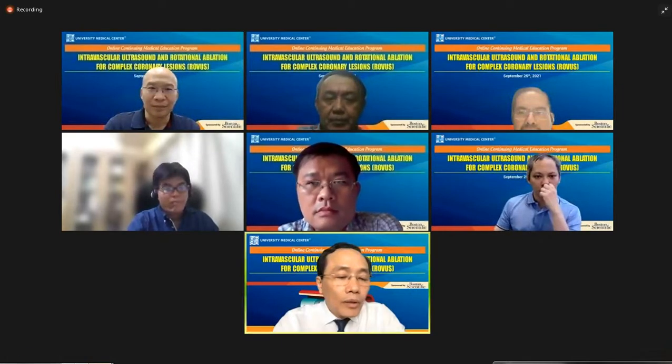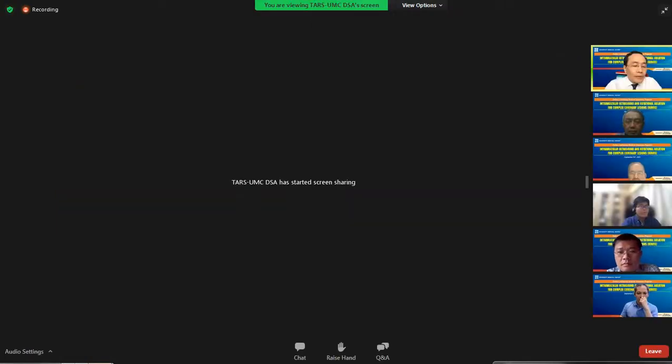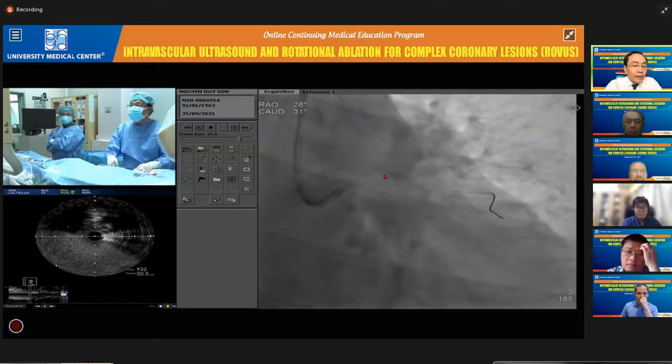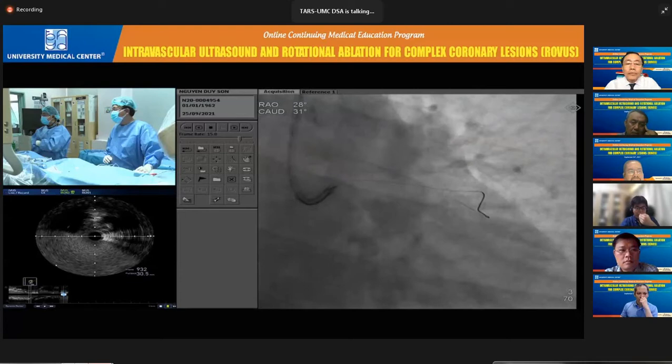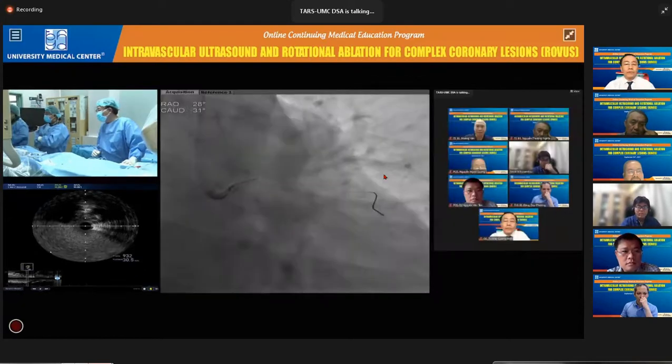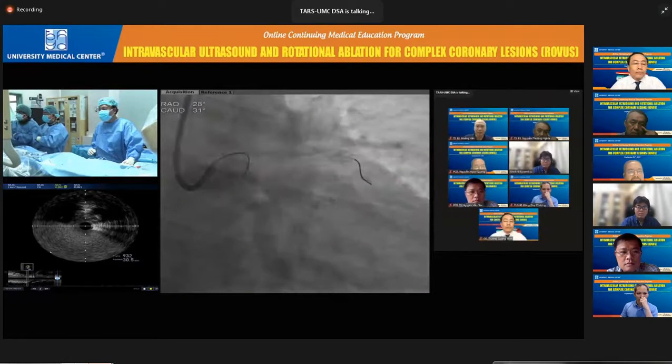So, Dr. Vũ, the angiogram is the past now. You check the angiogram now. Of course, I do it already. So, can you see the angiogram?